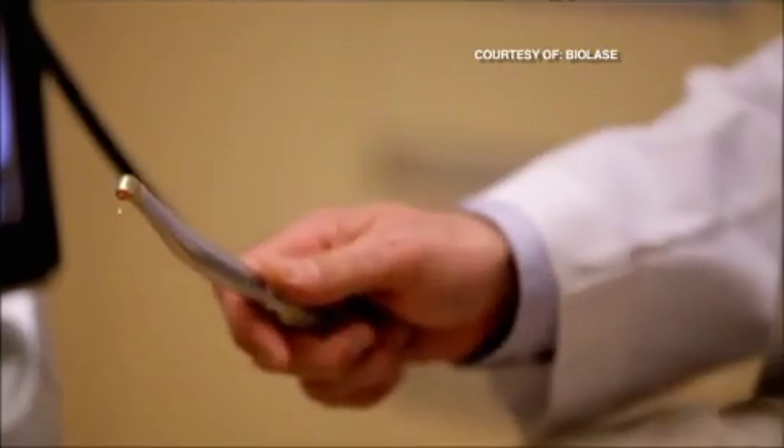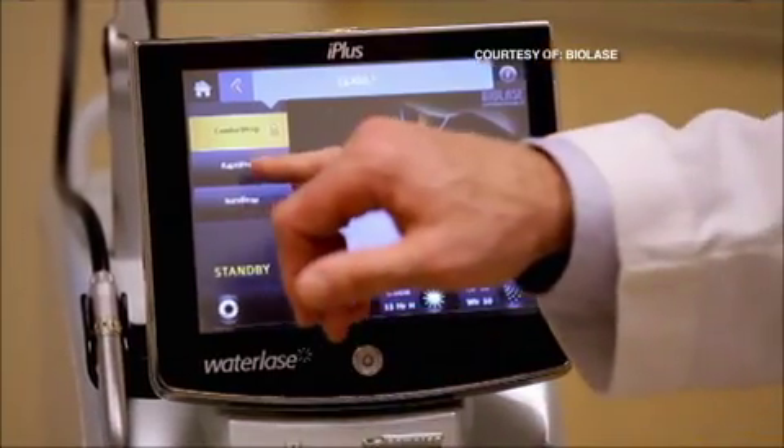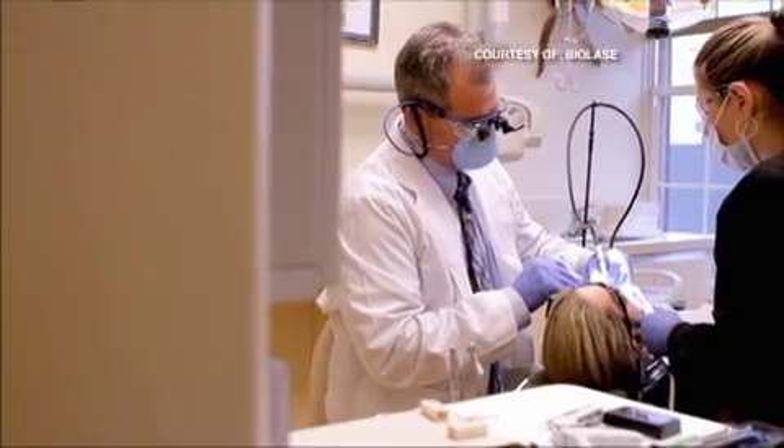This water laser can be used for many dental procedures, including filling cavities, performing root canals, and removing tooth or gum. Small procedures — in a few days you may not even notice that we did anything.